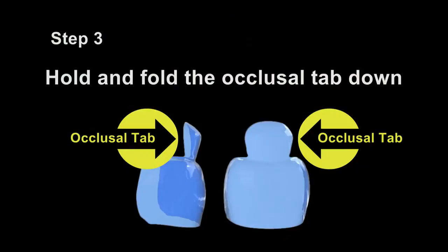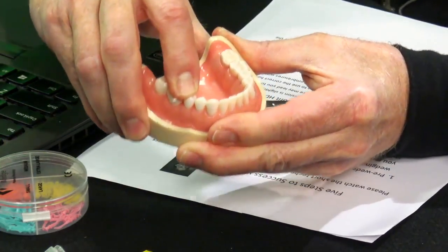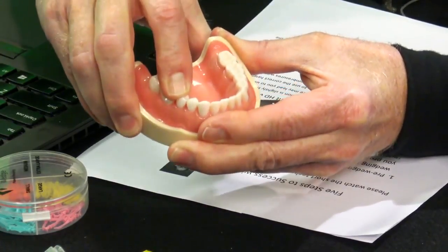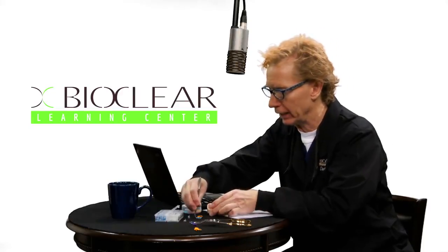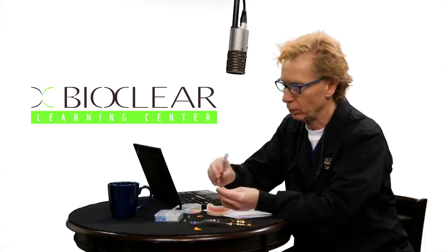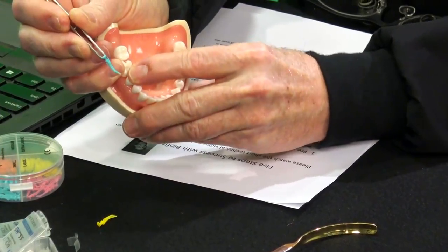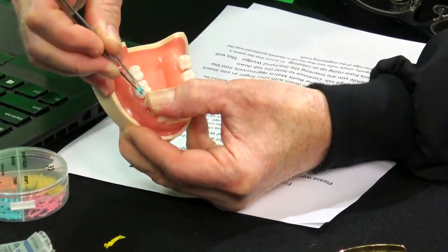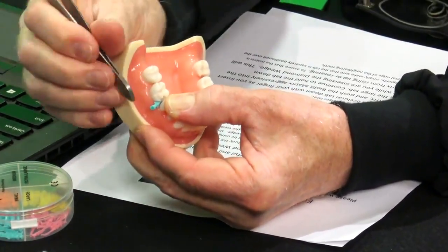Step three: hold and fold the occlusal tab of the BioFit matrix. Once you've inserted the matrix, take that little tab and press it down very aggressively against the neighboring tooth. That's going to bend the tab down — apply good pressure to drive it as far apically as you can. Then as you reinsert the wedge, make sure to press the tab down with your other finger. Drive the wedge interproximally and give it a push.